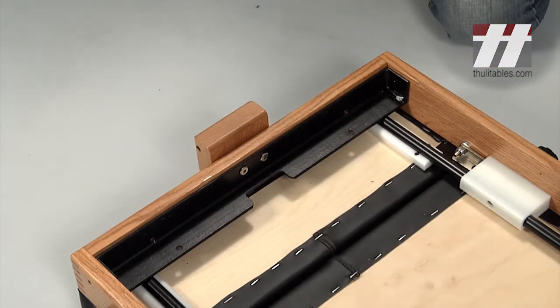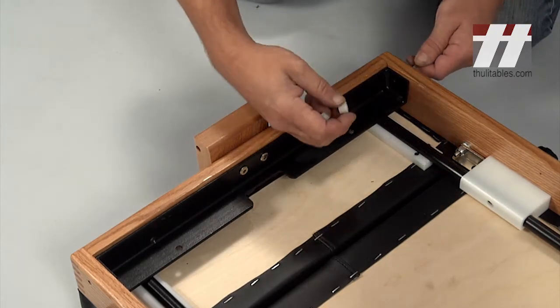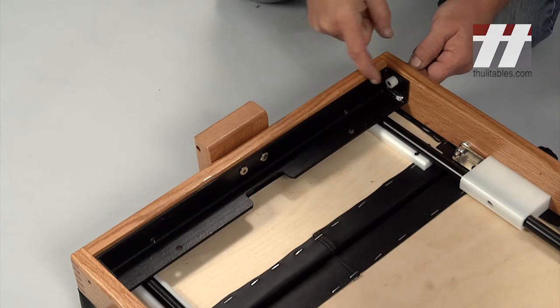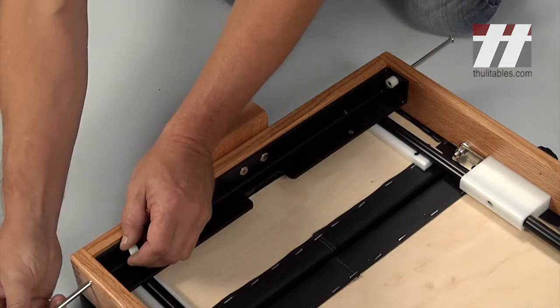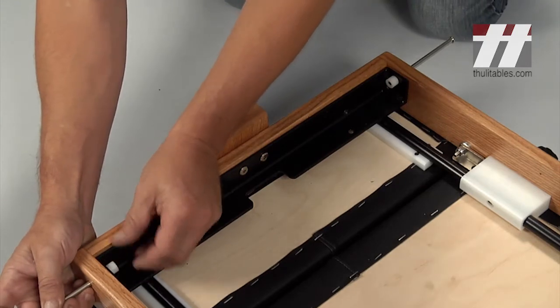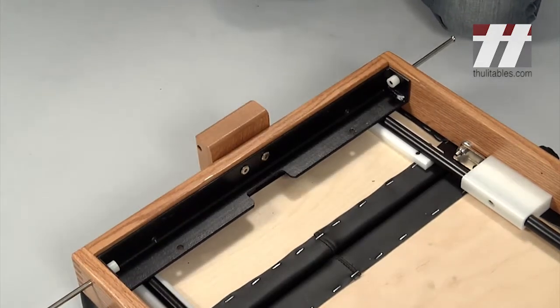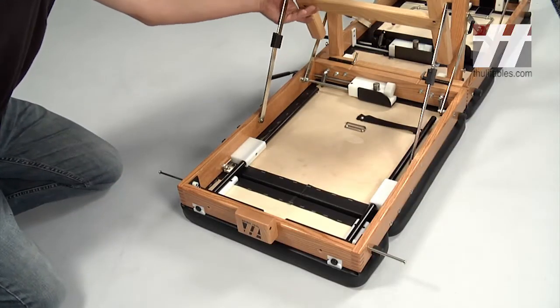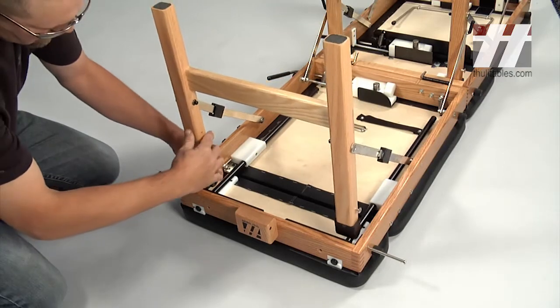To reattach the legs, first reinsert the leg pins through the frame, mounting angle, and new shorter spacers provided until flush with the end of the spacers. Swing the legs back into position and then insert the pins through the leg caps.